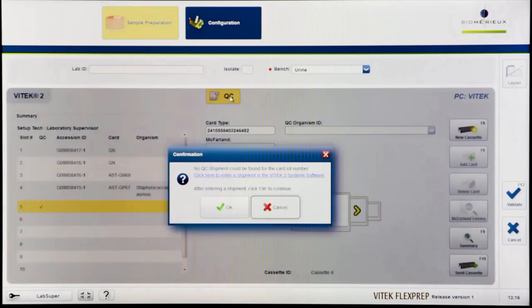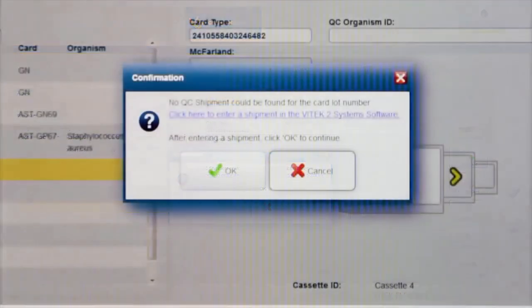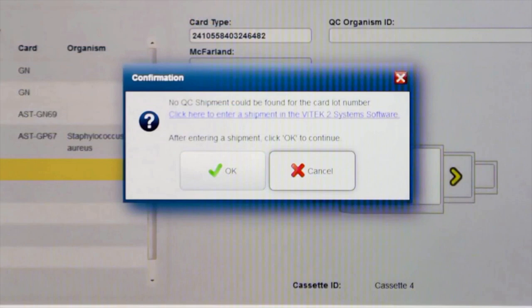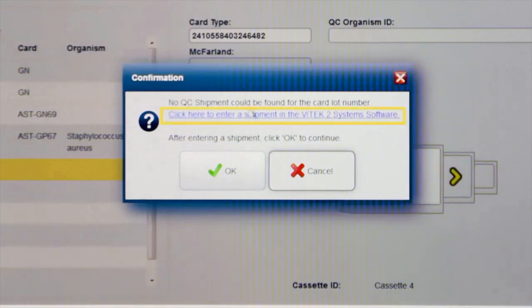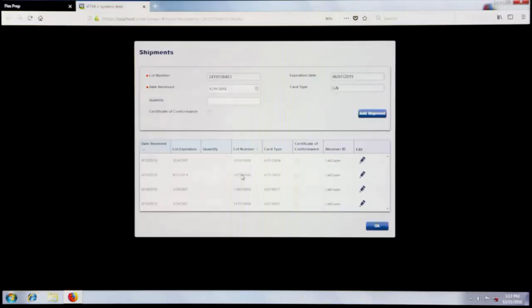If not, you will be prompted to enter the shipment information before proceeding. As seen here, the shipment information has not yet been entered for this card. Click on the link in the pop-up to navigate to the Vitek 2 web application where the shipment information may be recorded.